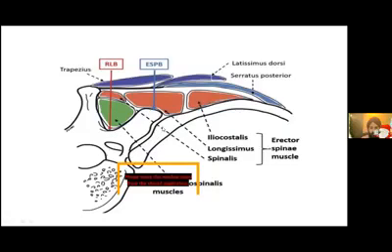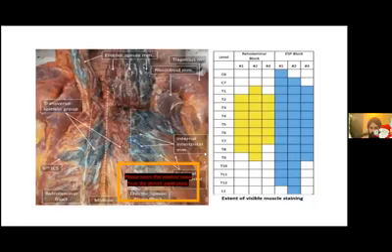And it was found that in a retrolaminar block, because this is the center, the dye was restricted more towards the center. It was epidural spread, but the spread towards the intercostal spaces was very less. Whereas in an erector spinae block, the spread was not only in the epidural space, as we saw in the MRI study, but there was also more lateral spread. So this was the advantage with this.